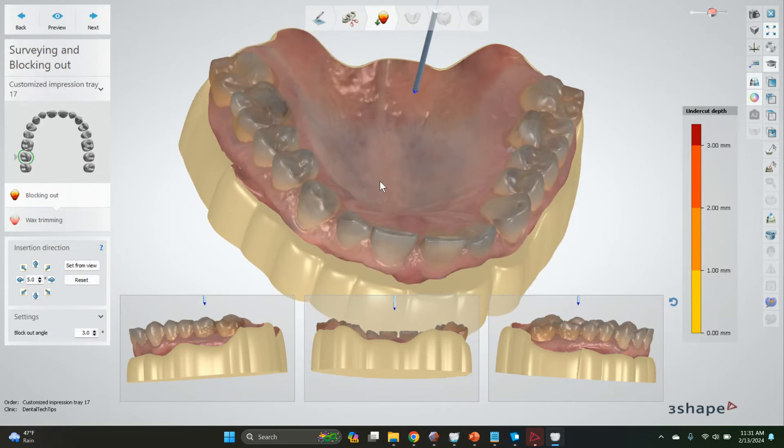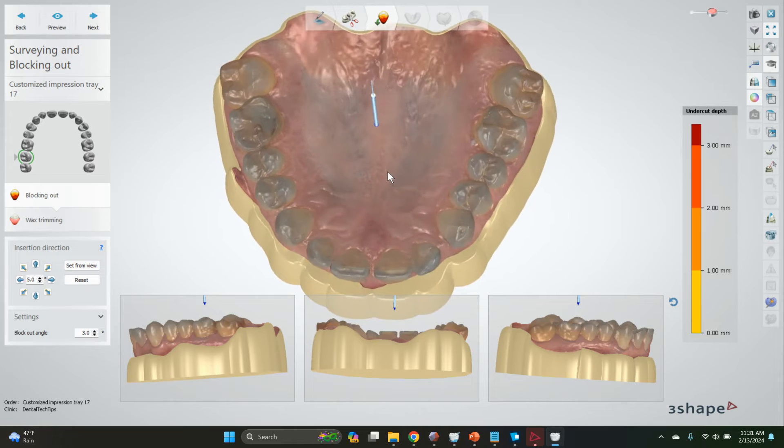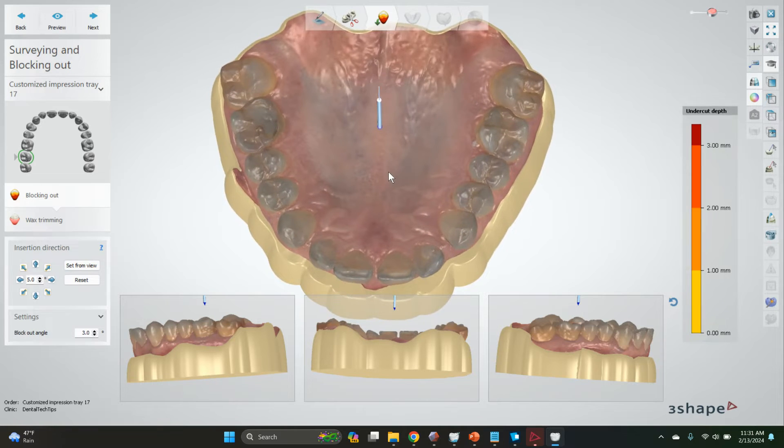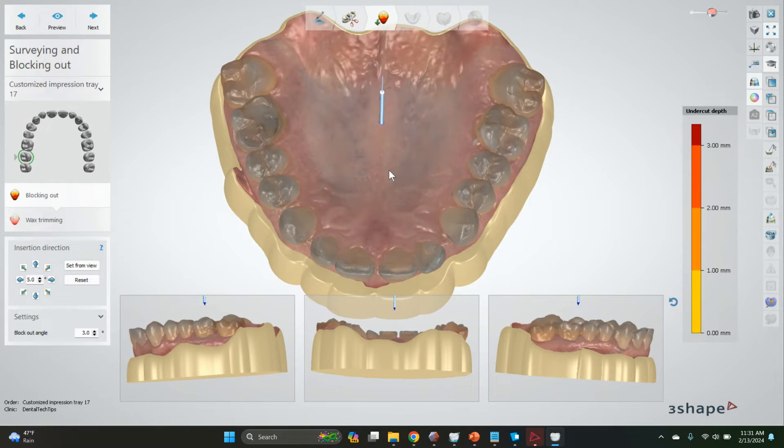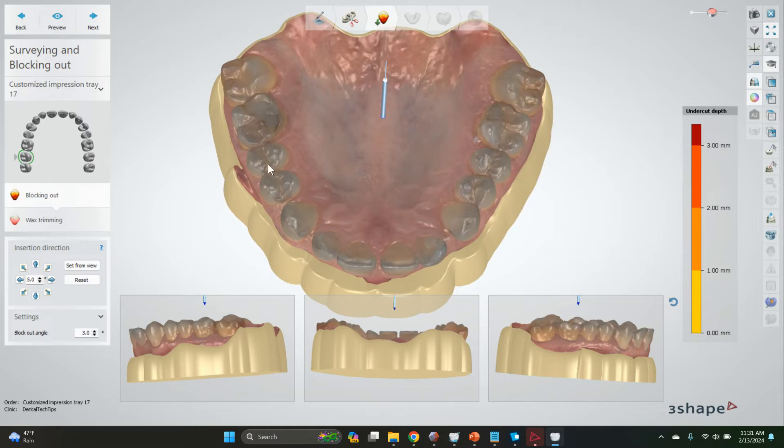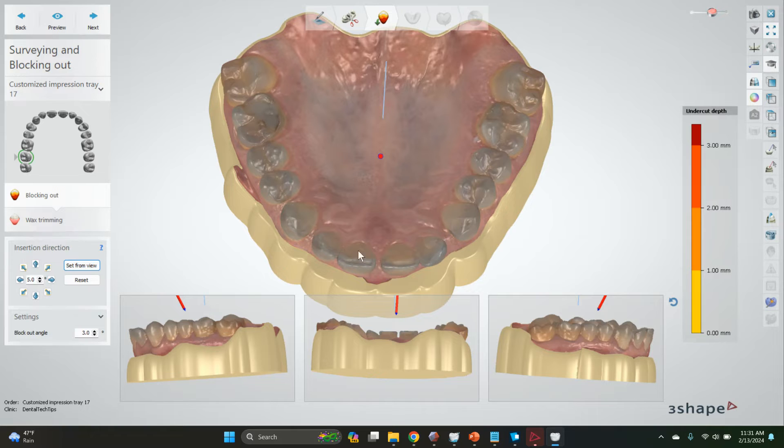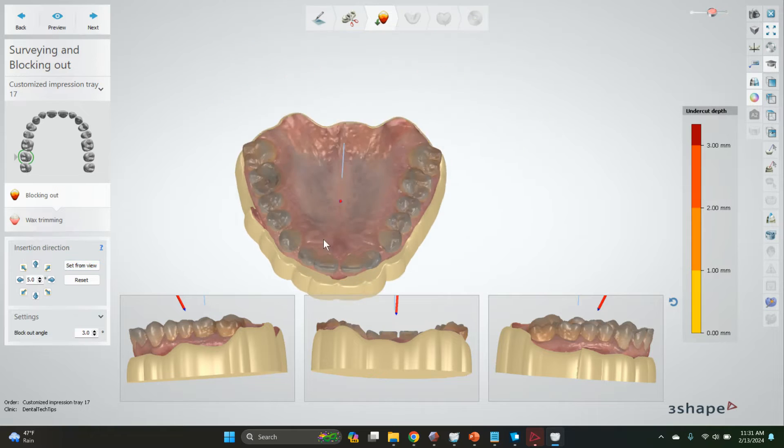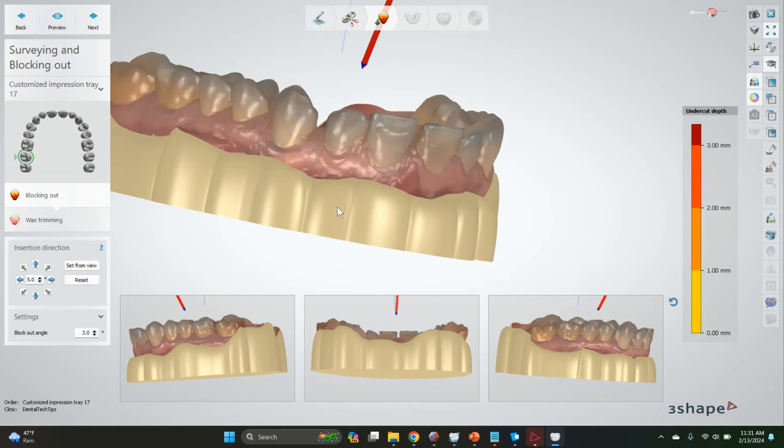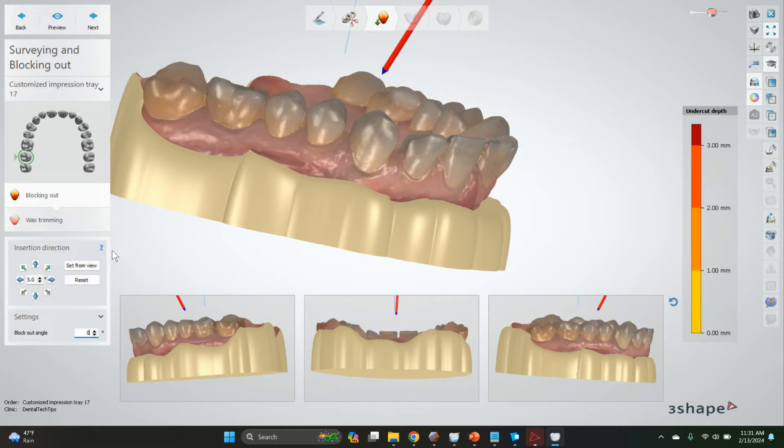We're going to set the direction that we want to block this model out from - let's say somewhere here. If you're trying to do something like this, we'll set from view. It'll give us by default a three degree block out. If you want a zero degree, that works too.